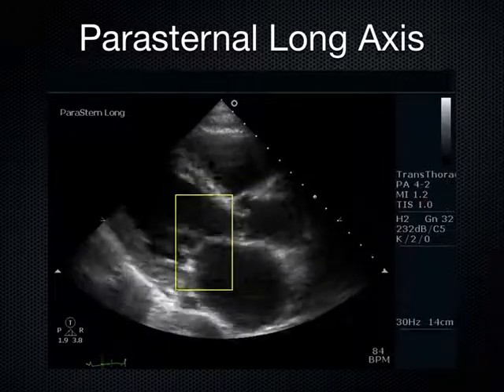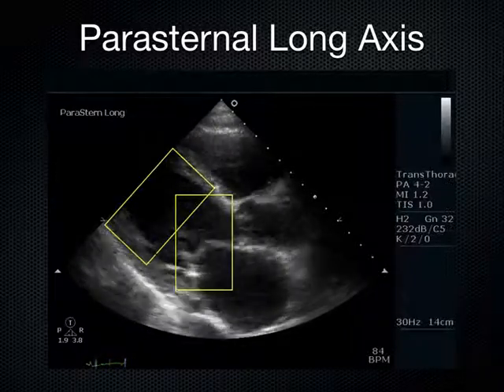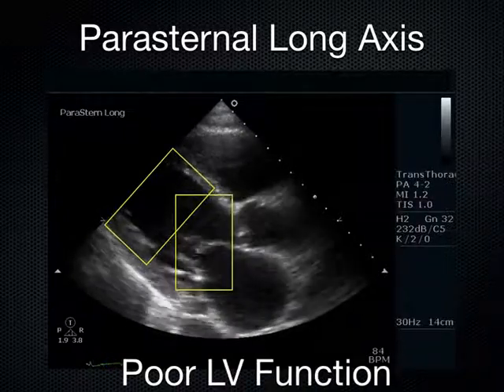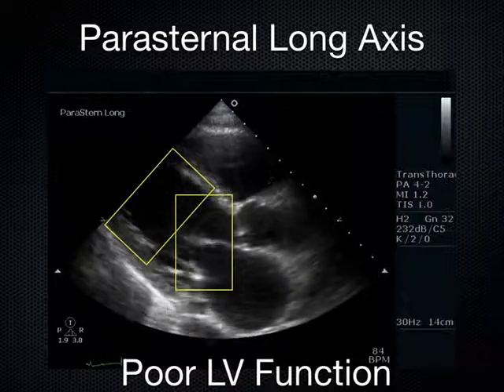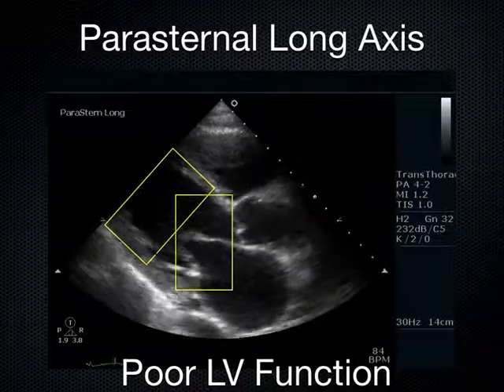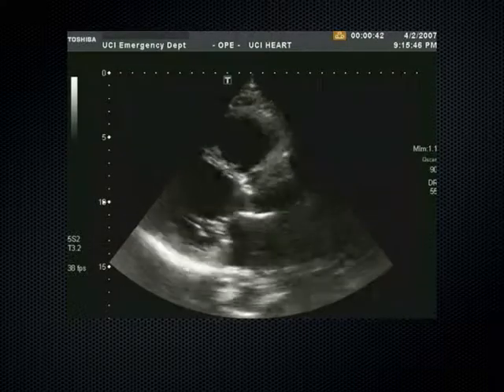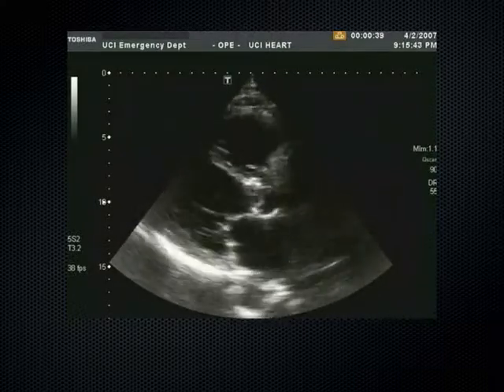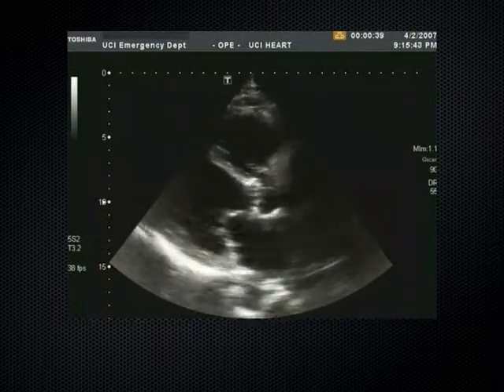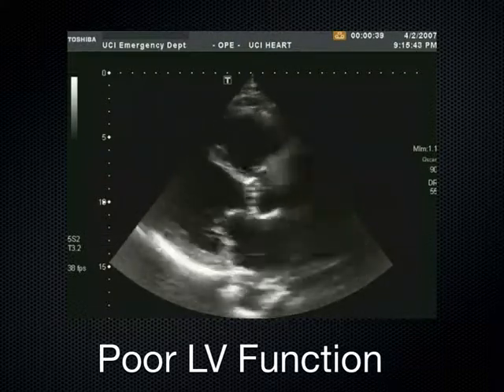Medications, exactly right. See that mitral valve there? Not really doing much towards the septum. And we come back there, we look at that septum and that posterior wall, not doing a lot for me either. Not a lot of delta in that chamber size between end systole and end diastole. You guys think about this? Medications or fluids? Medications, very good. Excellent. Any questions before I leave kinesis and move on to Doppler color?